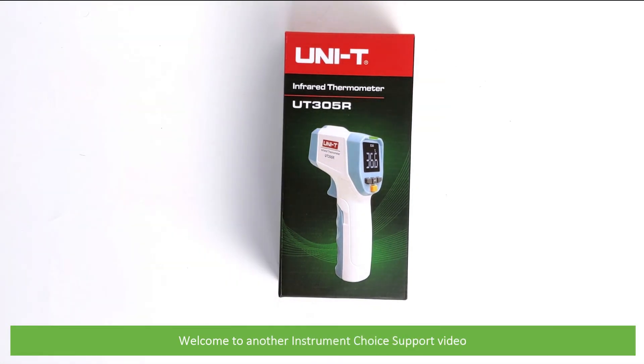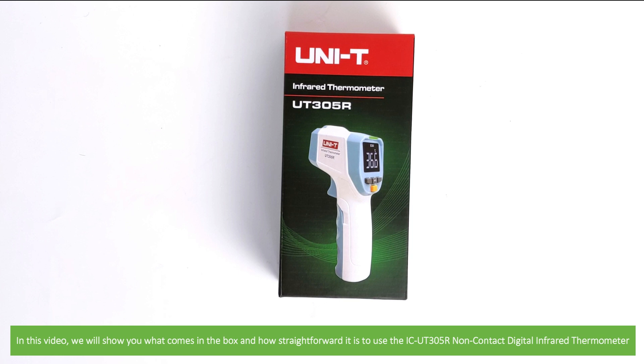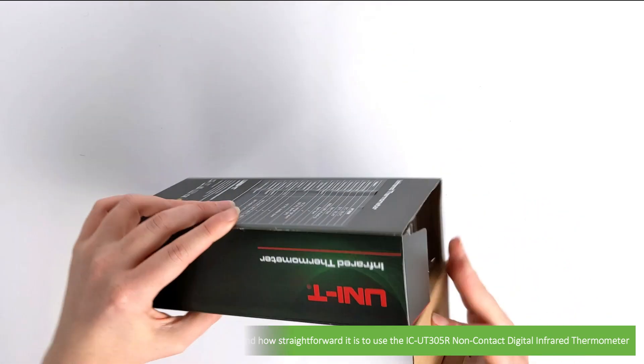Hi and welcome to another Instrument Choice support video. In this video we'll show you what comes in the box and how straightforward it is to use the IC UT305R non-contact digital infrared thermometer.